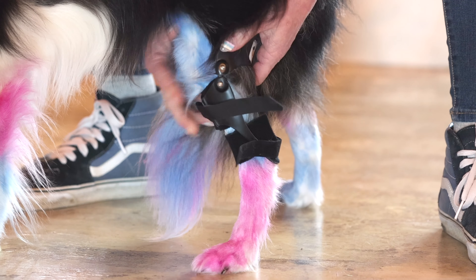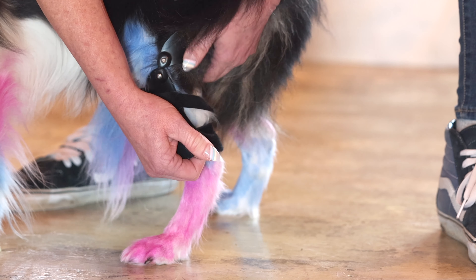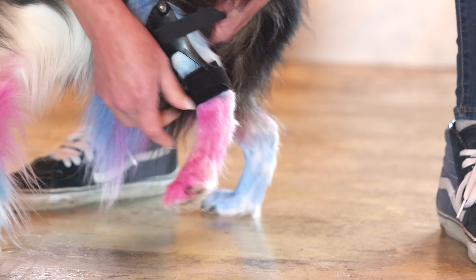Look down the end of the brace from the top. You'll see that the paw has to go through both little holes. Slide the brace on through the top and bottom portions. Make sure the bottom of the brace is above the hock. You may need to wiggle it a little bit to get it all the way up — just like that.